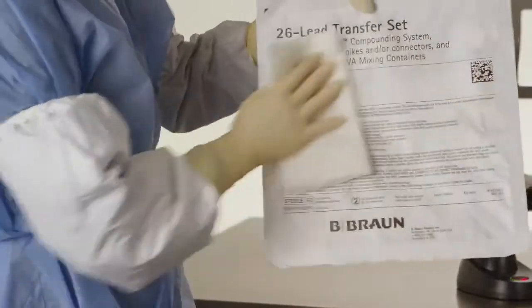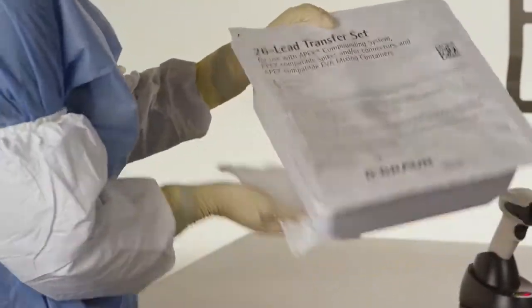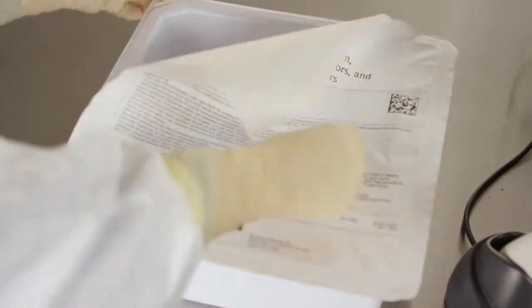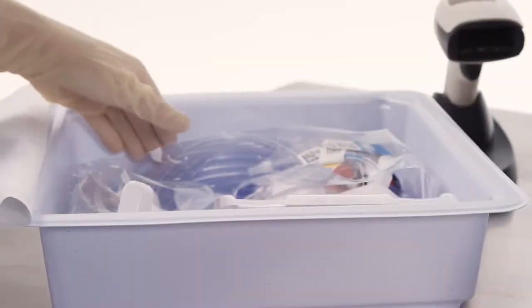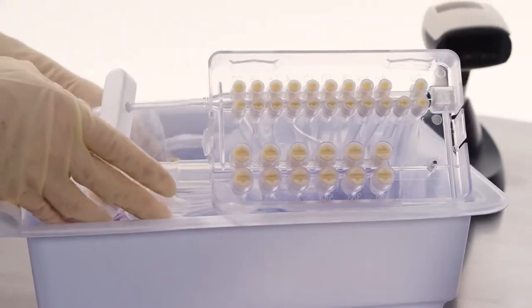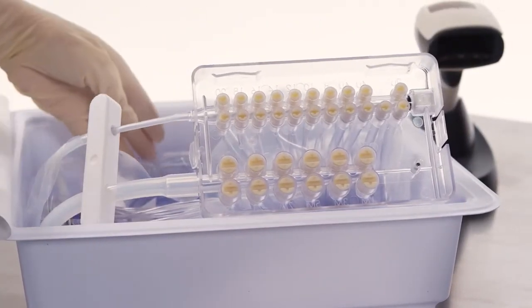Using aseptic technique, introduce the transfer set package into the laminar hood and open its outer tray. The transfer set lies within the tray contained in a partial plastic sleeve. While keeping the transfer set contained within the partial plastic sleeve, position the manifold on the edge of the transfer set tray.